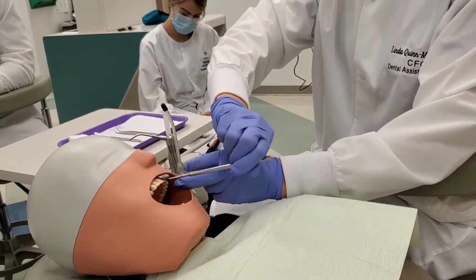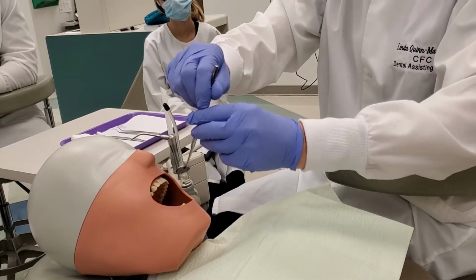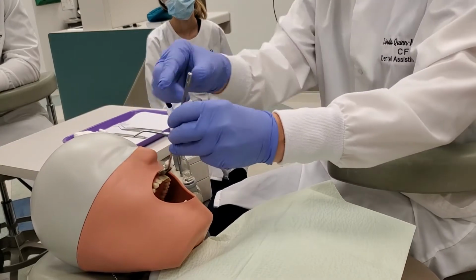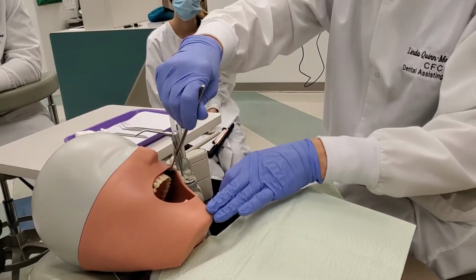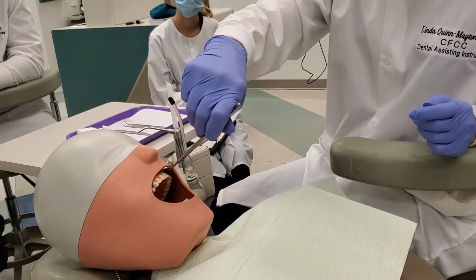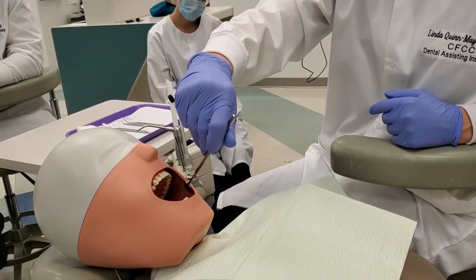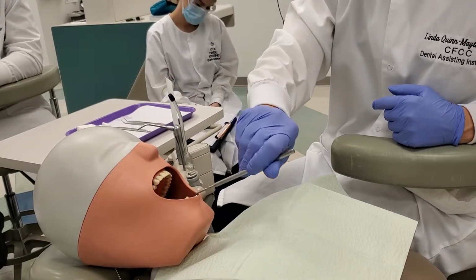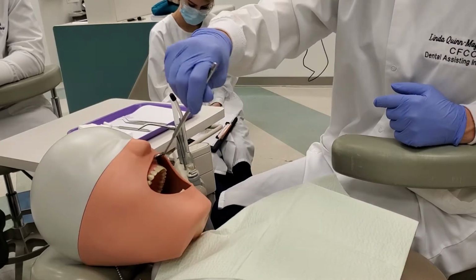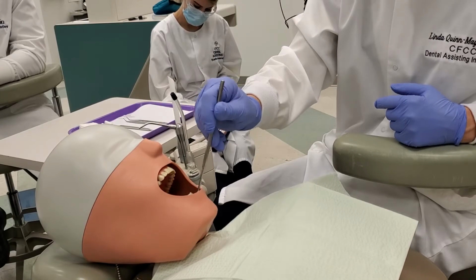Depending on whether you're left-handed or right-handed, keep in mind that the doctor is going to be sitting here, so you don't want to be in his way. The easiest thing to do is come around this way and retract that upper lip. Then you're going to use the mouth mirror to retract the lower lip. Again, use that tissue to come around, because you don't want to jam it right in there. Just start on the cheek. If you do an upper, retract up. On the lower, retract low.